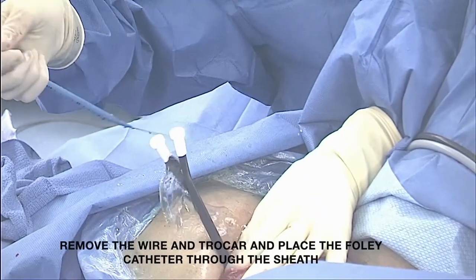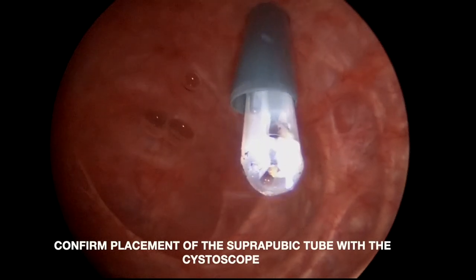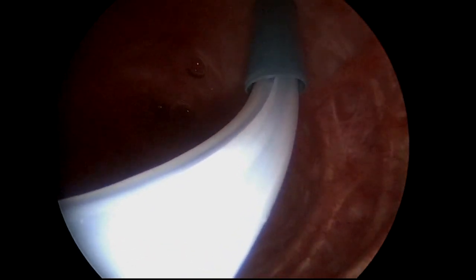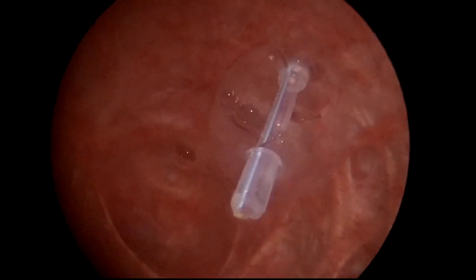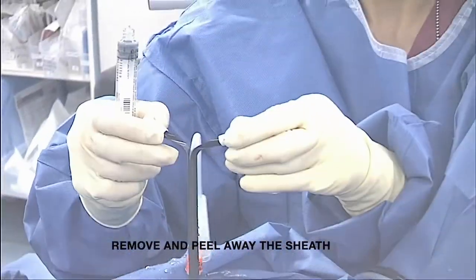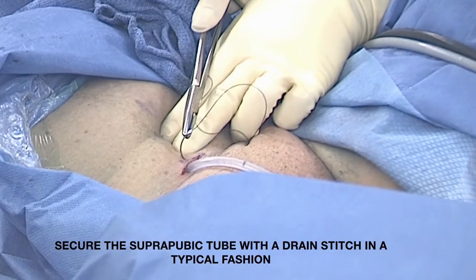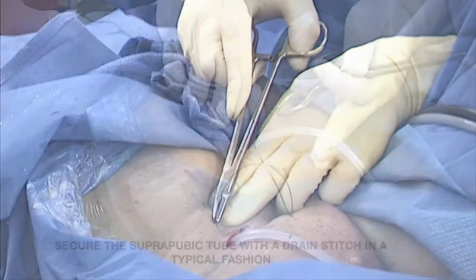Remove both the wire and the trocar and then place the Foley catheter through the sheath. Then cystoscopically confirm the placement of the suprapubic tube within the bladder. Then inflate the balloon to secure the catheter. We can now remove and peel away the sheath. Lastly, we secure the suprapubic tube with a drain stitch in the typical fashion.